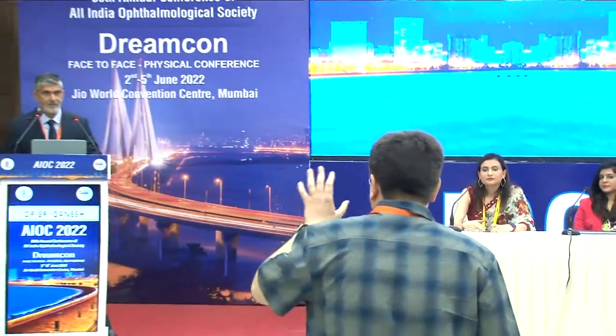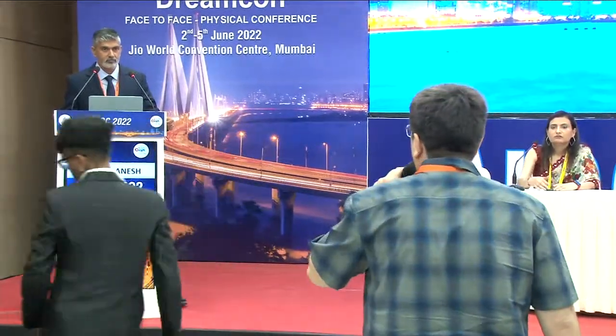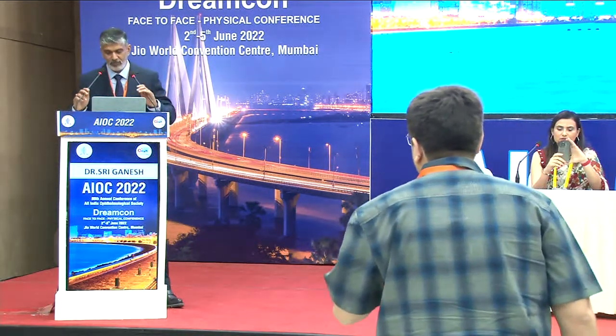Sir, you said the Pentacam tends to overestimate the keratoconus, but I think it is only limited with the smaller white to white. What are the other parameters? Because if the patient's white to white is between 10.8 to 11.4, then I have seen that it tends to overestimate the keratoconus. But apart from them, is there any red flag sign? Would you like to say for the Pentacam? Because the majority of you all have the Pentacam.